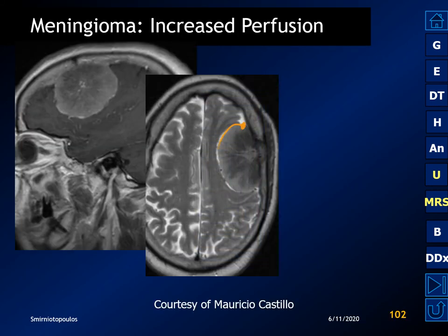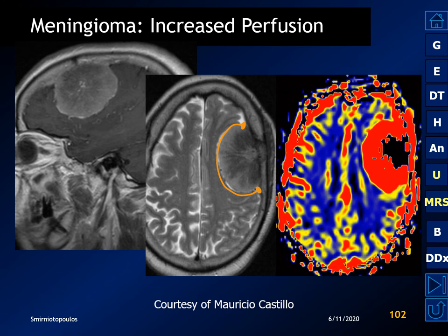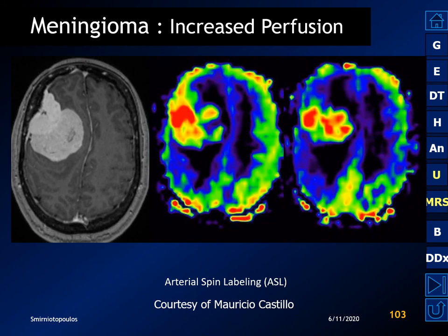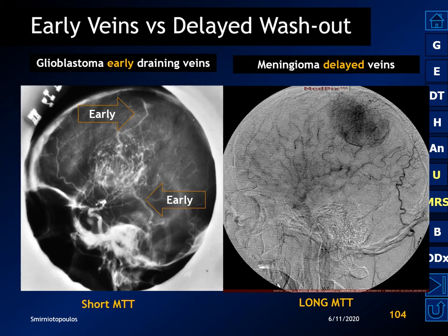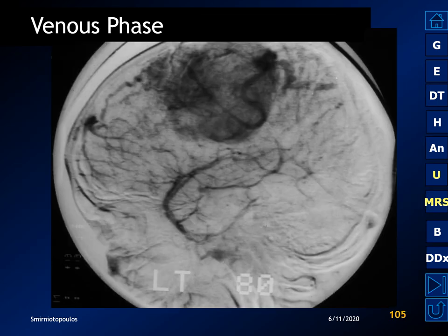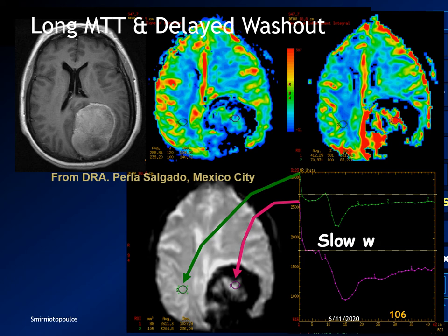On perfusion imaging we see an incredibly hot tumor with dramatically increased cerebral blood flow. Comparing a glioblastoma multiforme with a meningioma, we notice in the meningioma a delayed appearance of veins, a prolonged capillary phase — the tumor blush — and in the venous phase, persistence of contrast material within the tumor capillaries, very different from most hypervascular tumors. Curves demonstrate very slow washout — a distinctive characteristic suggesting a meningioma.